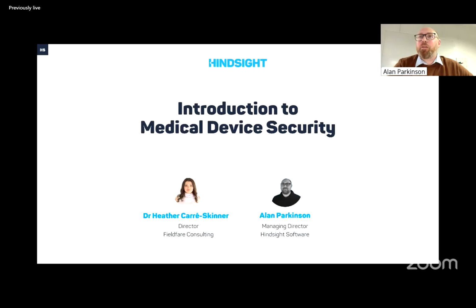If you use a library, what's the provenance of that library? It's on a library management system or a package management system, and you're consuming it from there. But is it the original version that matches the source code? So there's a lot of work on digital signatures and manifests to actually provide traceability, to make sure it's come from who it says it comes from.